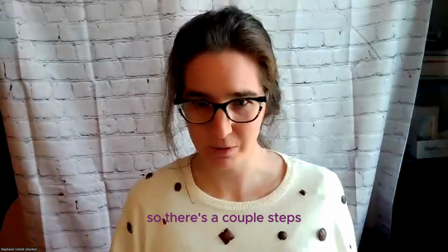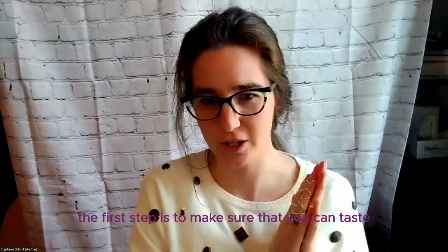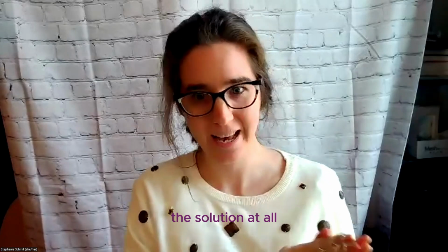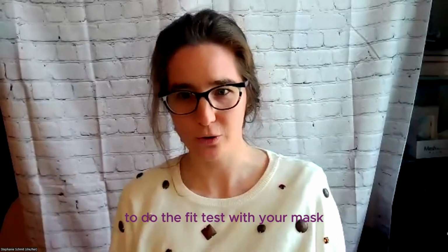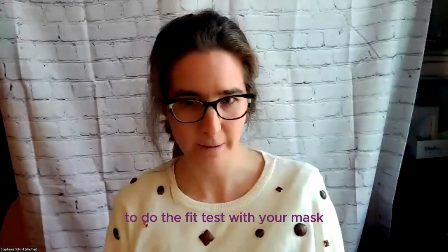So there's a couple steps. The first step is to make sure that you can taste the solution at all and to figure out what concentration to use. And then the second step is to do the fit test with your mask.